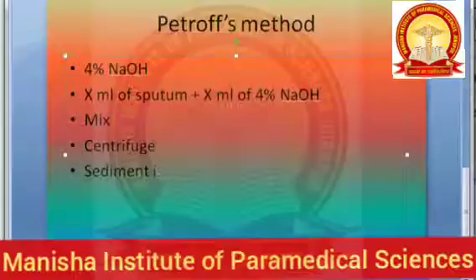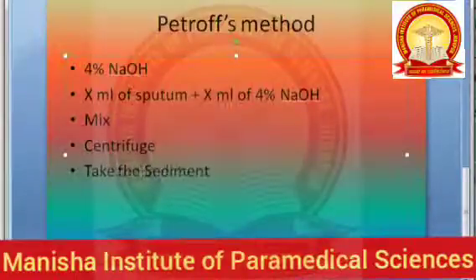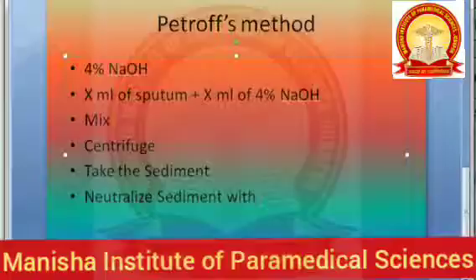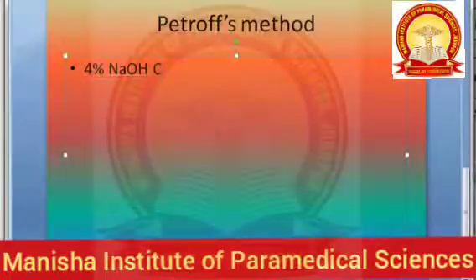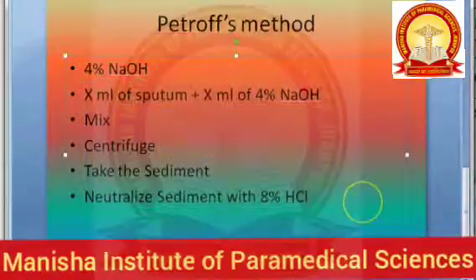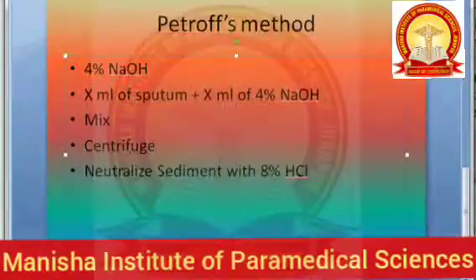You take the sediment and neutralize the sediment with 8% HCl.